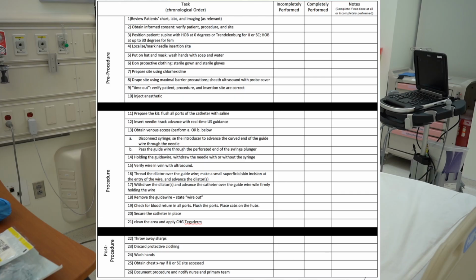We'll proceed with our informed consent, going through the 5 components of that as we discussed earlier. And then we'll certainly start to position ourselves. Ultimately, we'll talk about that later, utilizing universal precautions, and then doing our timeout and proceeding with the procedure details that will follow subsequently, followed by cleaning up of our environment, verifying placement, and then communicating verbally and written documentation.